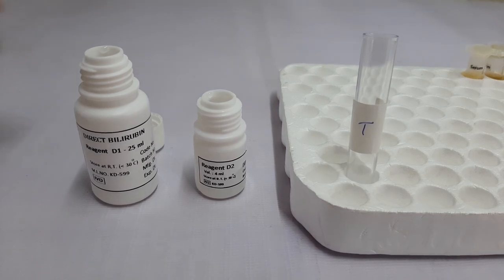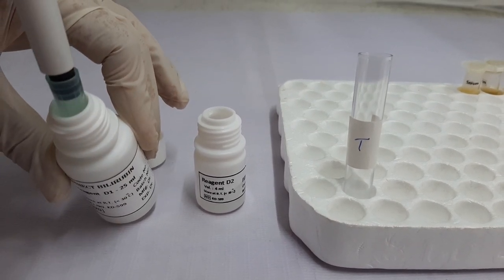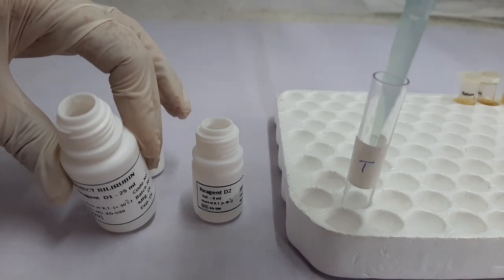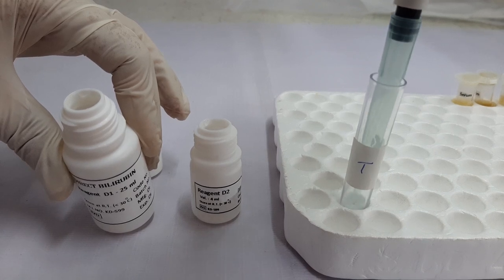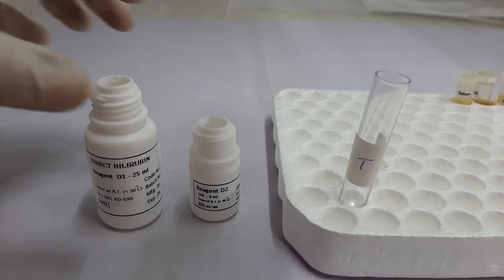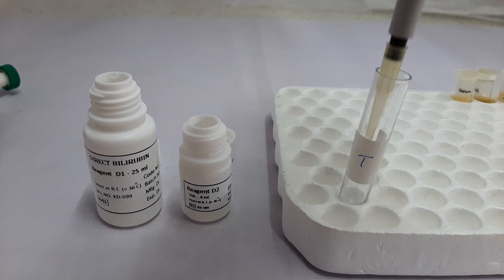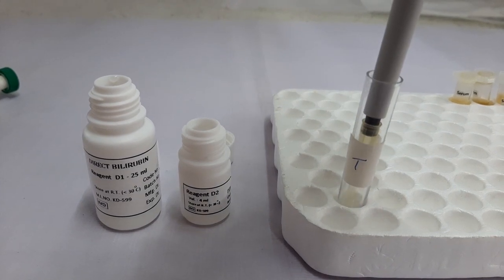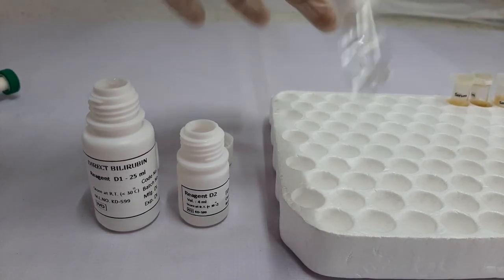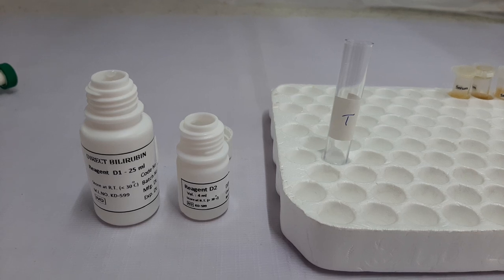So first we will prepare the working solution. To do this, we will take 1 mL of D1 reagent without any air bubble and then add it to the tube which is already labeled for the test, in which we will add 20 µL of D2 reagent. Then mix the components of the tube. Now our working solution is ready for addition of the sample.